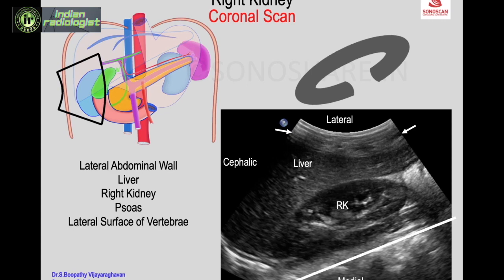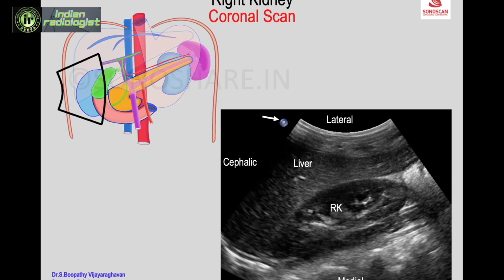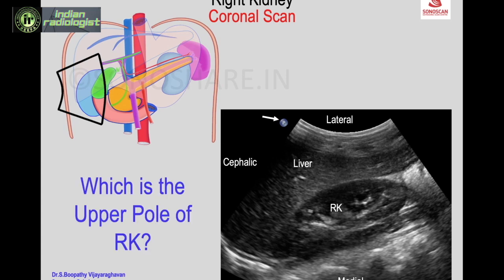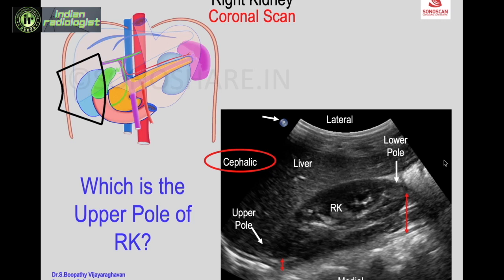You also see the psoas muscle medial to the right kidney and the lateral surface of the vertebra seen as a white line with shadow. Since the probe mark is cephalic, the upper pole is towards the head. Above the upper pole is the adrenal area; the lower pole is more laterally placed than the upper pole, which is normal — because the psoas becomes bulky lower down, it displaces the lower pole more laterally. The psoas is marked by the triangle.